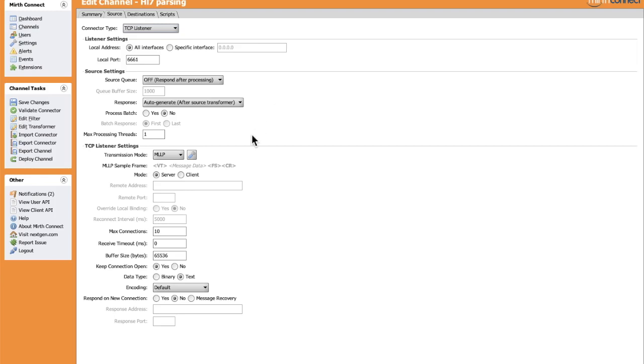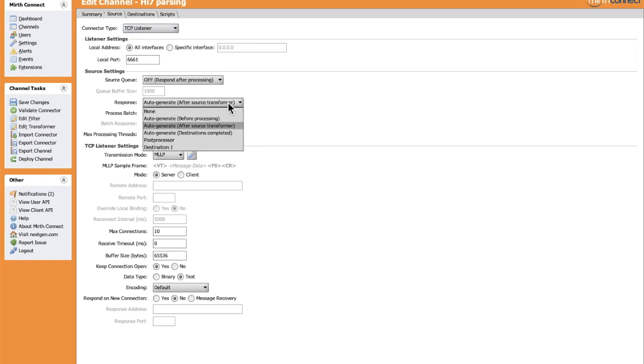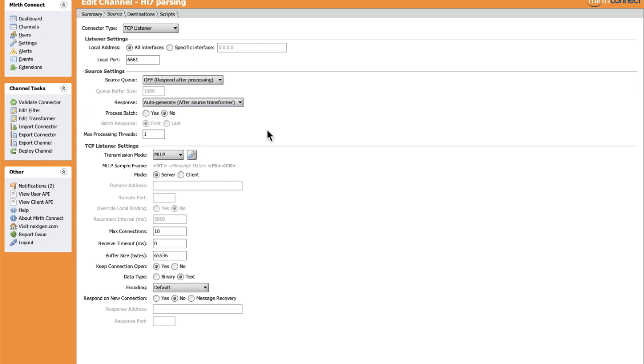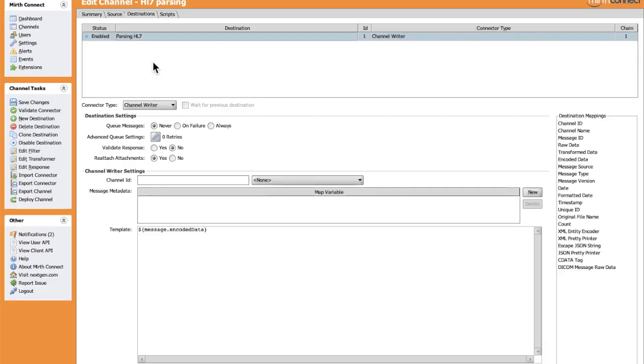When we receive an HL7 message, what is the response we're going to send to the external system? Here we can specify a destination. The idea is to specify a destination whose role is to return a response to the external system. By default, we will keep MLLP TCP listener setting. Let's save. After configuring the source where we're going to listen to HL7 messages, we can parse the HL7 in the destination or in the source as well.